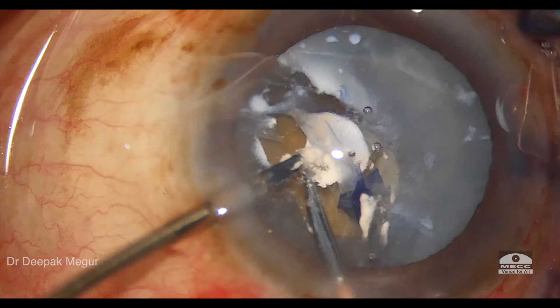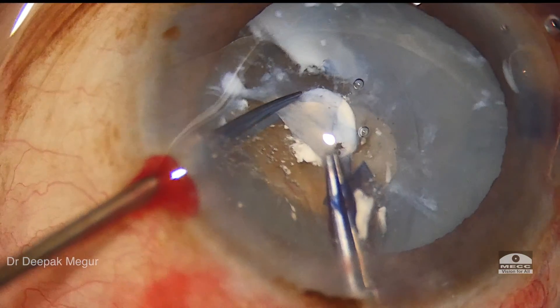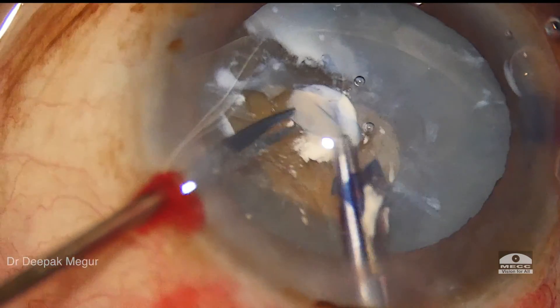The key message here is that we need to deal with these calcified plaques first so that the rest of the capsule can be handled in a much better way.